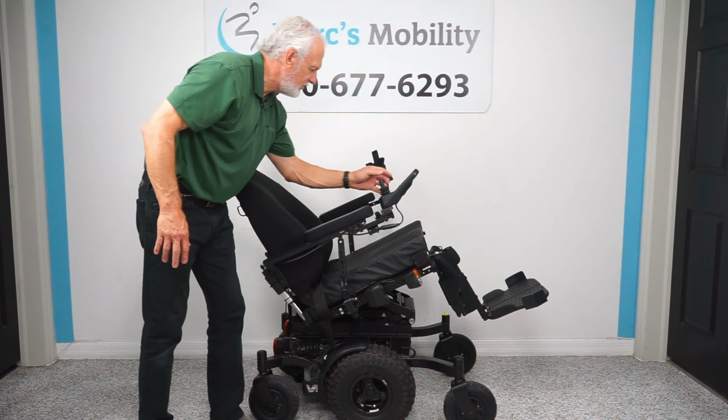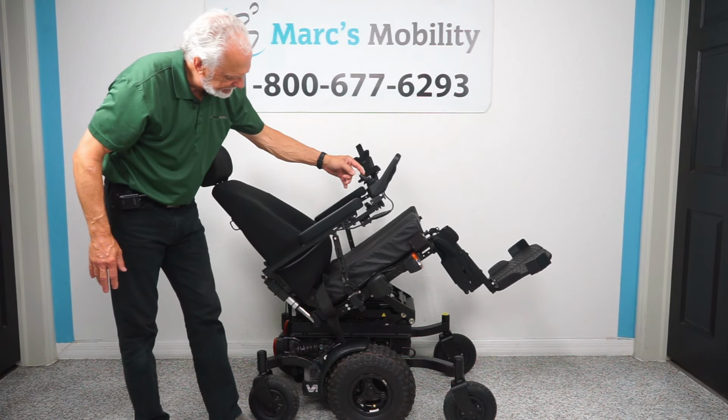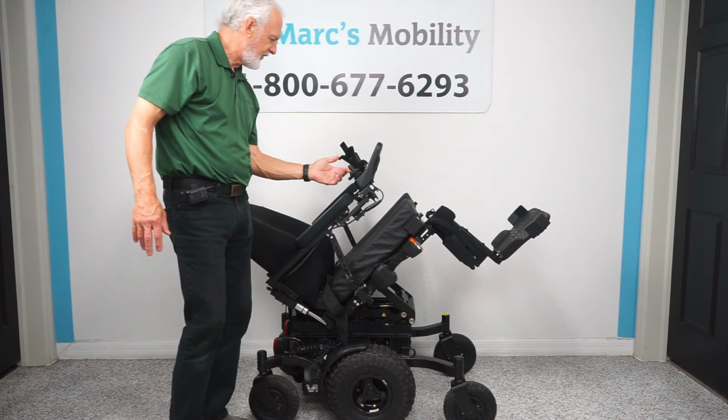So we're going to go back to the mode and keep going back to show you how far back it'll go. So this is your electric tilt. Now the next thing I'm going to show, I'm going to move this sideways again to the feet.